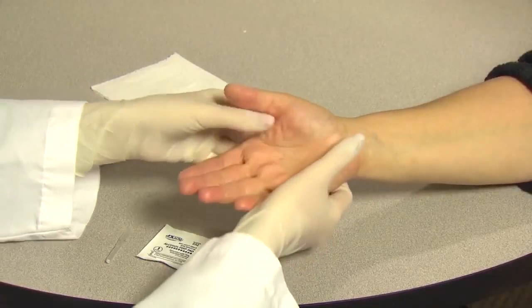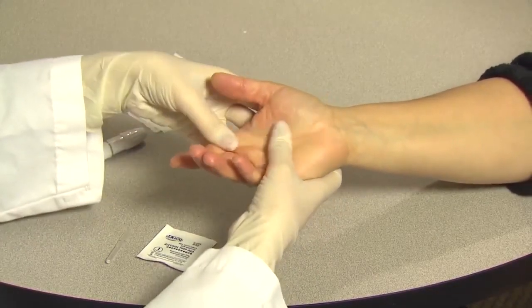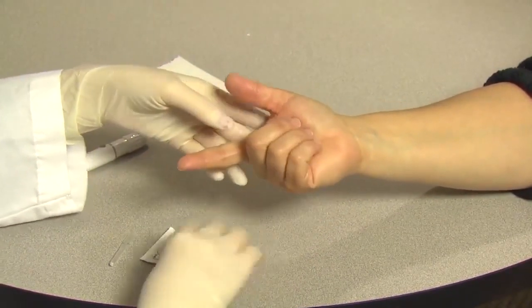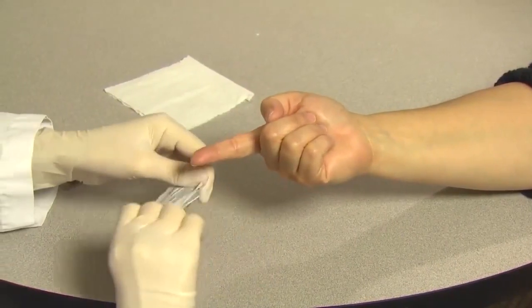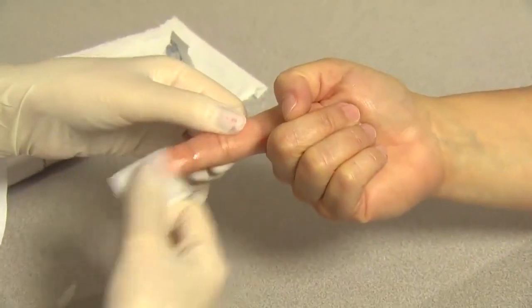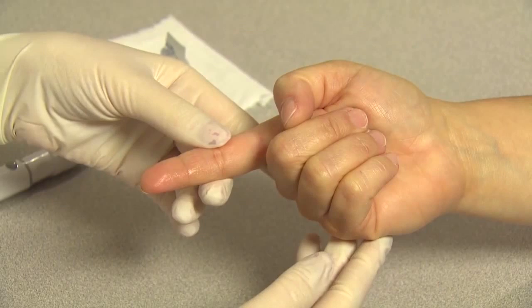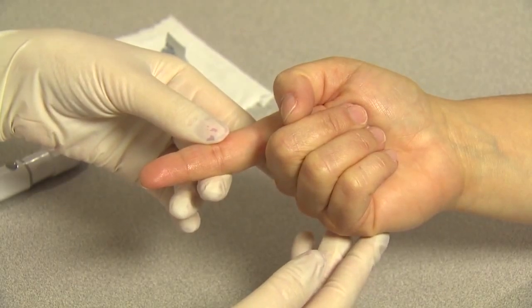Massage the hand from the wrist up to the fingertip a few times to encourage blood flow. Clean the testing site by washing your hands with warm soapy water and then dry them thoroughly. You could also choose to use an alcohol swab instead to clean the testing site, and then let it air dry completely before testing.